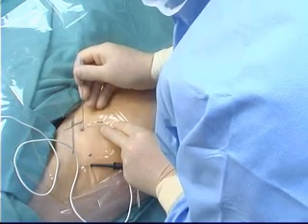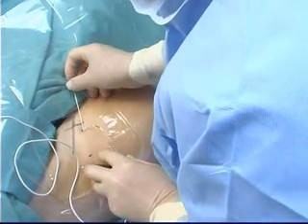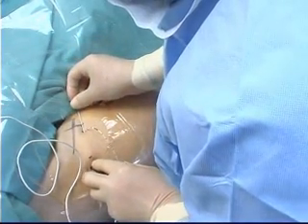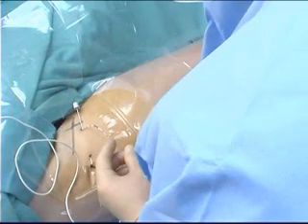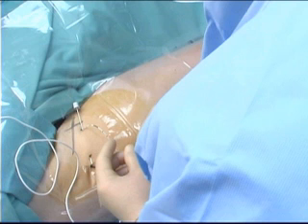The catheter is tunneled by first inserting the inner stylet of the needle 1 to 2 millimeters from the catheter exit site if a skin bridge is required, and advancing it subcutaneously to a point approximately 8 to 10 centimeters laterally if this is appropriate for the surgery. This area has previously been anesthetized. The skin bridge will make removing the catheter easier, but this has to be balanced against a higher frequency of leakage of the catheter.